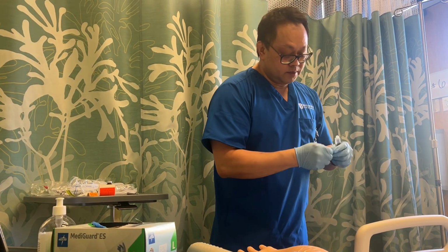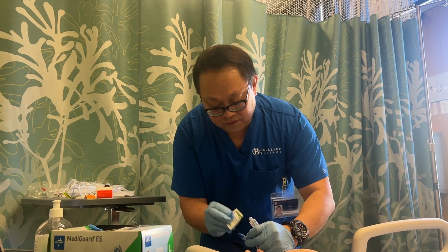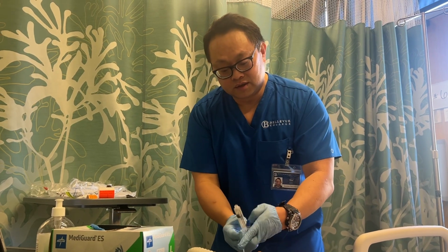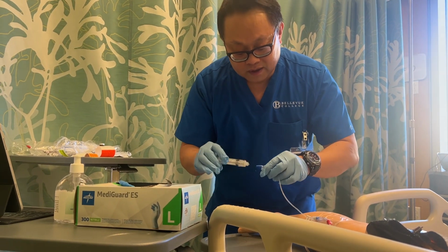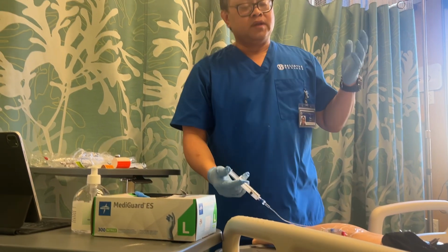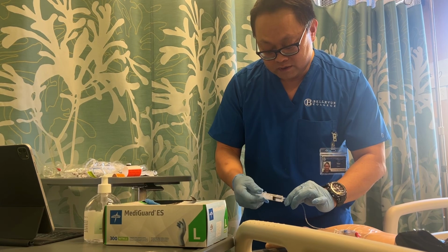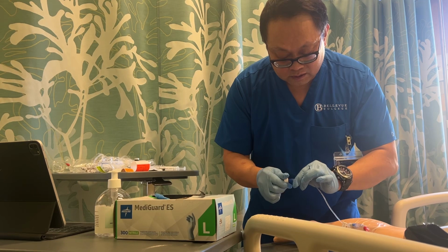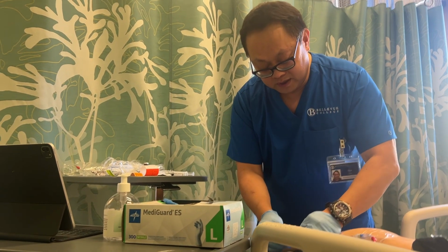Okay, so I'm going to uncap this, scrub it for 5, and ideally I would wait 2 minutes after the medication administration. I would scrub it for 15 seconds, let it dry for 5, and then I'm going to connect it again. Ideally, you want to flush the first milliliter at the same rate as the medication, and it is flushed at the same rate as the medication. And again, I am going to lock it. Okay, we'll pretend that that is a cap.